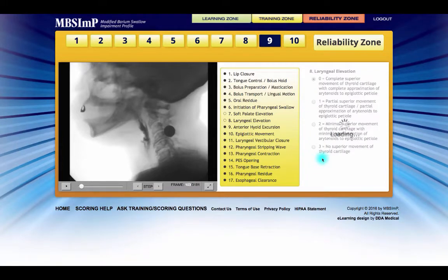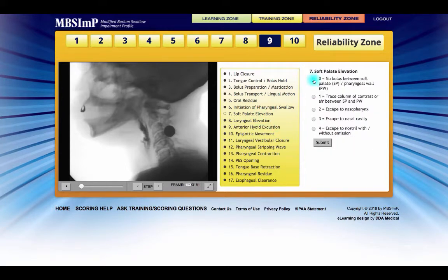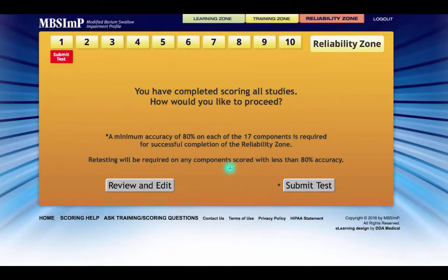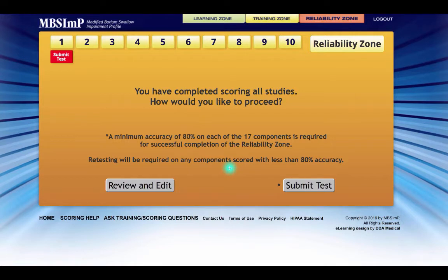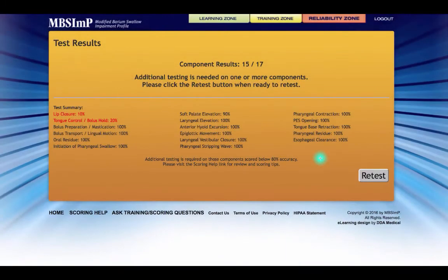In the reliability zone, however, the scores are not returned to the system until the score for each component in each of the 10 studies has been submitted. At this point, when the scoring of all 10 studies is complete, a new window appears instructing the learner to submit all scores for evaluation and determination of success. Until that icon is clicked, the studies remain available for review and the scores can be changed. Once the submit icon is clicked, the scores are returned to the system in bulk and feedback is provided regarding whether or not the reliability criterion was achieved.